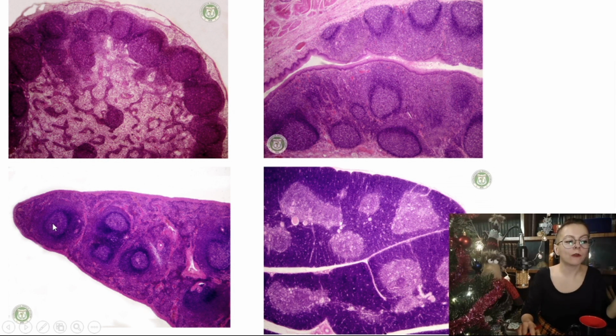In the spleen, follicles are distributed uniformly. They are neither in the center nor in the periphery, uniformly, without any characteristic pattern. Okay. In the tonsil, follicles are aggregated along the crypt. So here is the crypt, the invagination of the epithelium, and on each side, follicles are located along this line. So if you can see this space, this invagination, this empty space line, then this is probably a tonsil.